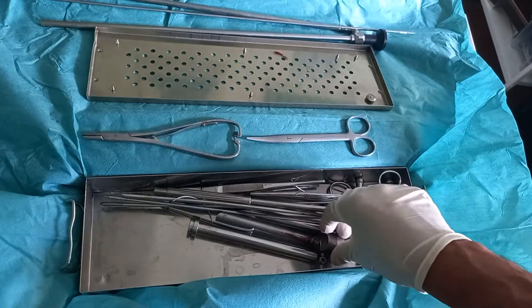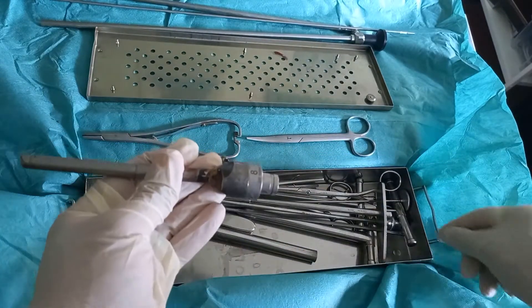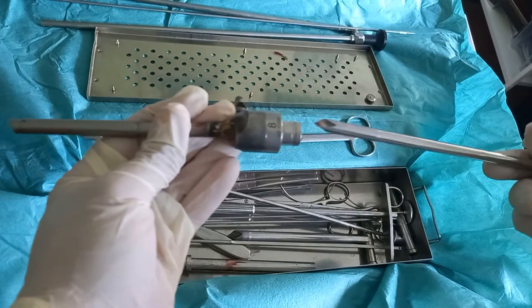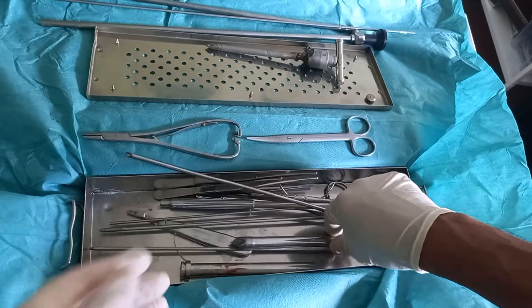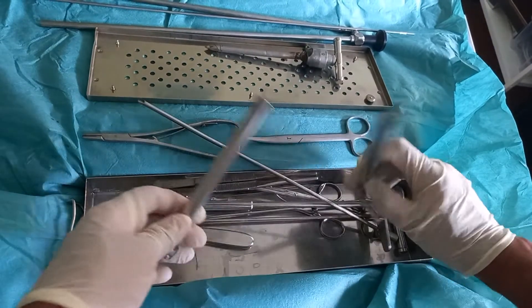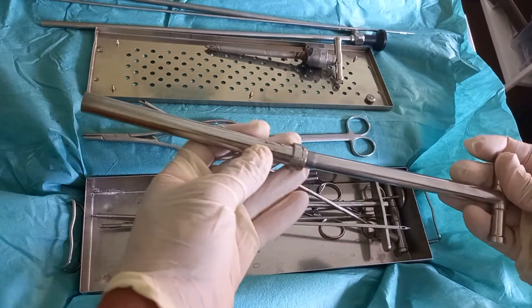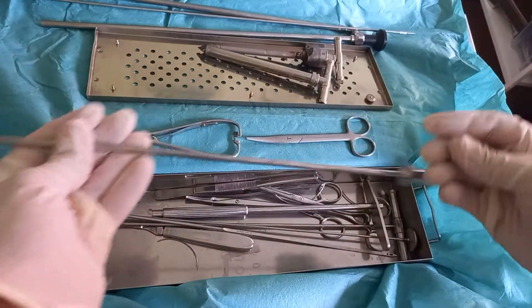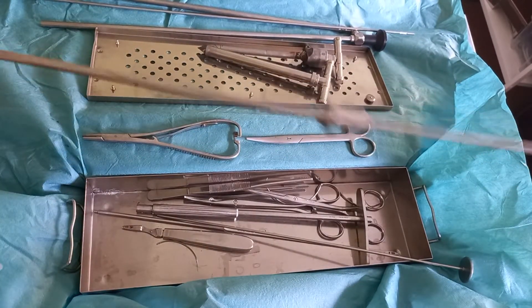Then come three types of trocars. The first one is the endoscope trocar, from which we will later insert the endoscope. Then comes the work trocar, from which we will perform most of the steps of the operation. The third trocar is the abomasal trocar, by which we will later puncture the abomasum and insert the toggle to fix it.